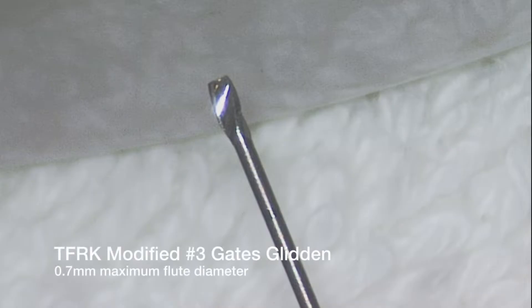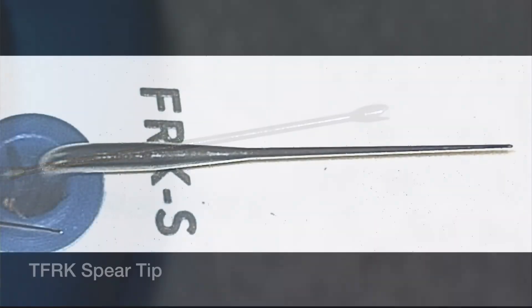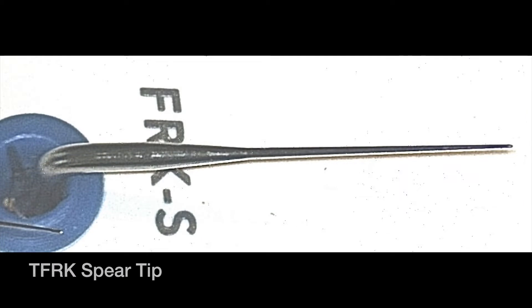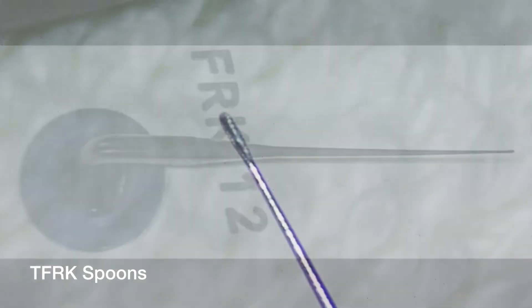The kit components include a modified number three Gates Glidden Burr, a Treffine Burr, a spear-tipped ultrasonic device, and two spoon-shaped ultrasonic devices to aid troughing.